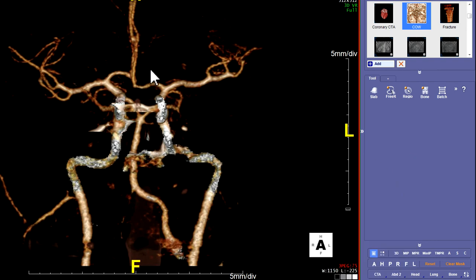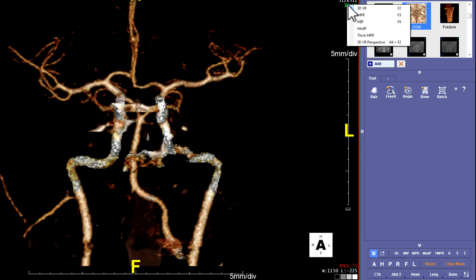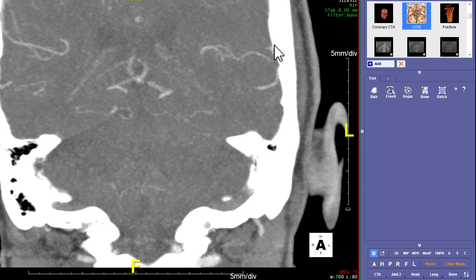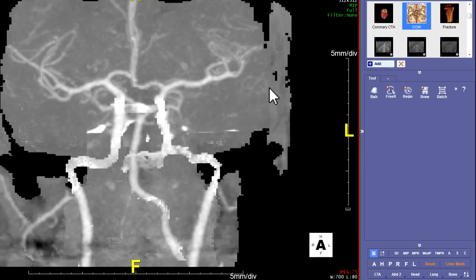Now all we have to do is change this to the MIP. We already have all the bones cut, so we just go to these green letters up here. Anything with a green letter can be right-clicked on and changed. Look for these green letters, and where it says 3D, right-click on that and change it to MIP. When you change it to MIP, do not panic when all the bones and the cuts come back. All you have to do is go down to the next one where it says slab 8, right-click on that and say full, and then all your things go back on there.